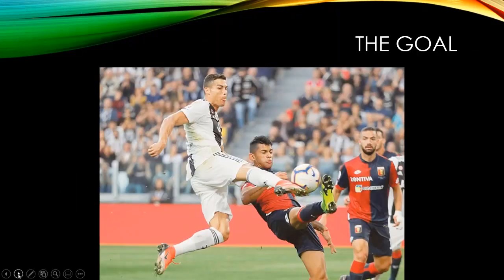So what's the goal? Obviously, to make something amazing happen, there's a lot of pieces that go into that. Planning, here in implant planning, is a complex series of events that have to occur properly to have this very predictable outcome. It's a fine dance, if you will. It's great planning, as in a soccer game here. It's really no different. The level of sophistication is no different.